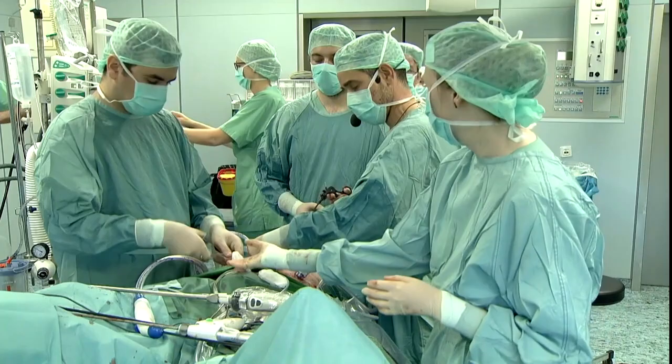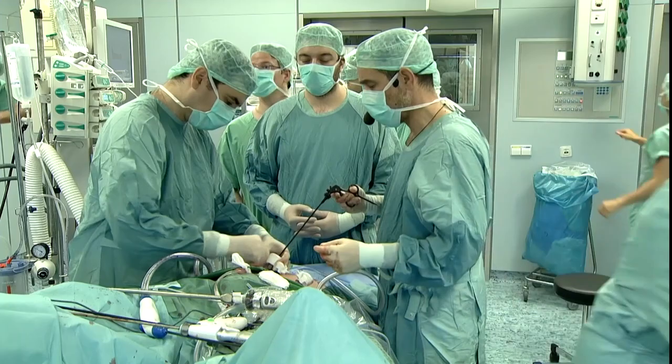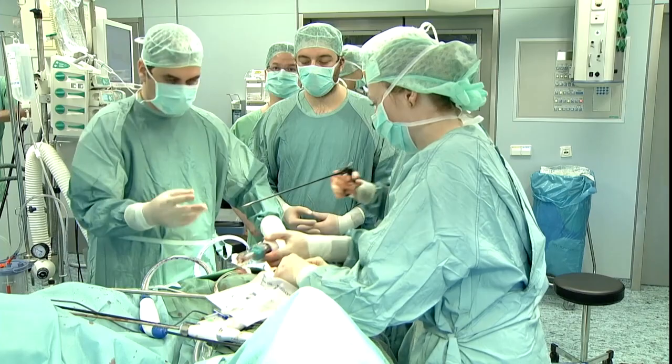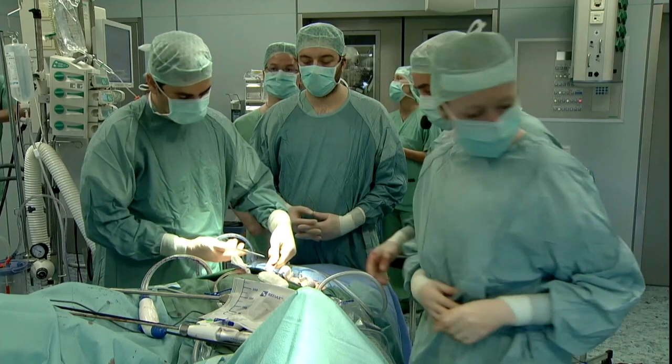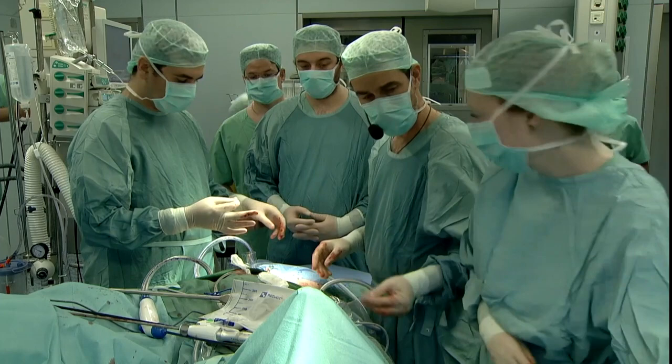Are you happy the drain is nowhere near the small intestine? Are you happy the drain trocar site is far away from that small intestine? Yeah, the drain will come out anyway later today, so this is not a big issue. Put a grasper here for me. So having done this, we're done. It was quite difficult to initially go in, so we spent a lot of time inside, as you noticed.